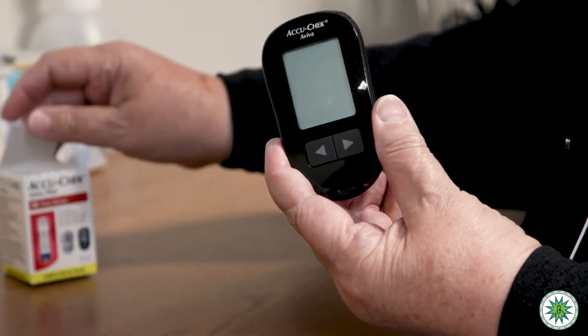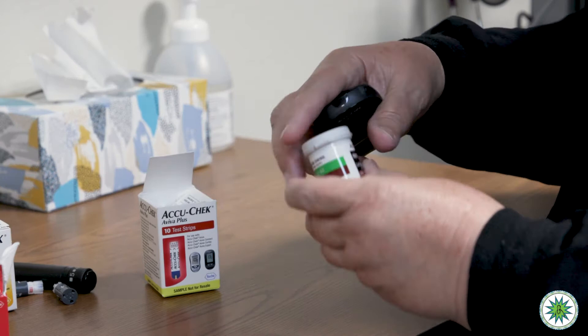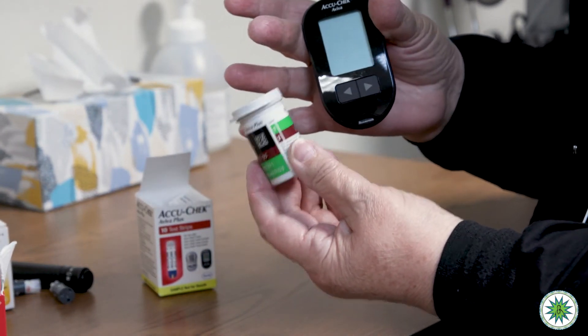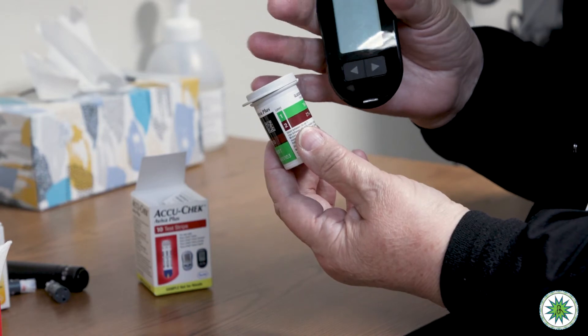I want to start off by telling you that the current system you're using is still accurate. It is the AccuCheck Aviva meter that many of you have had — we've had this meter in this system for many years, probably more than five years, and they use the AccuCheck Aviva test strip. If you still have test strips, you can continue using them until they're gone. But when you need refills, the pharmacy won't have these strips to refill anymore, and at that point you'll have to switch to a new system.